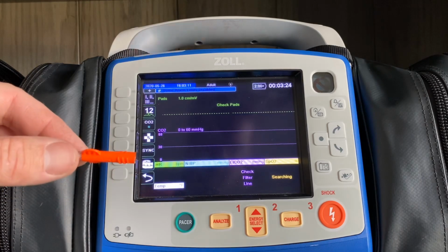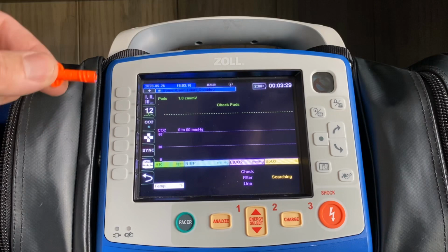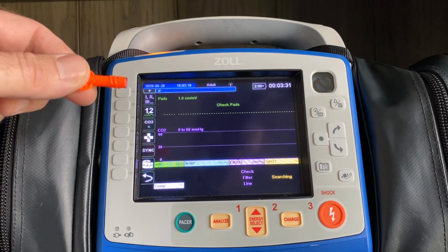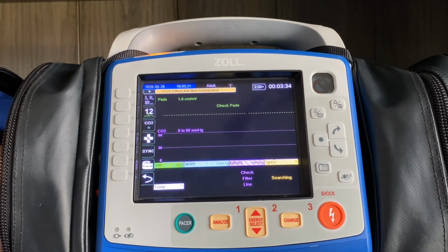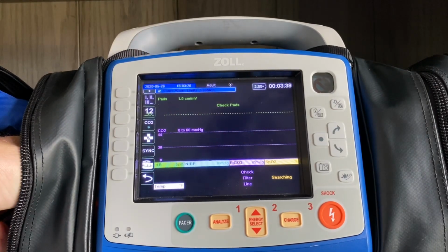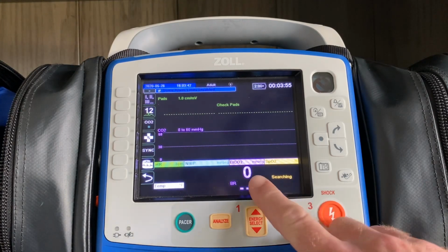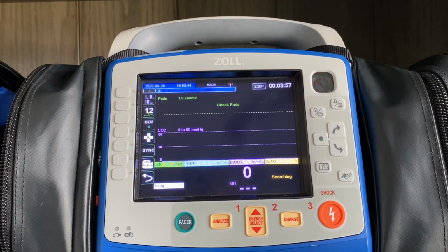So you want to take the end of this. There's a door in the left-hand pocket that moves up and down. So the easiest way is to take just the tip of this adapter, move that door down, and turn it clockwise until you feel it stop. Now that's a threaded connection. So depending on where you stick that in, it'll turn about halfway or three quarters of the way and you'll feel it stop. And immediately then you'll hear the pump start up. And I'll show you the waveform that's produced, the millimeters of mercury value, and the respiratory rate.